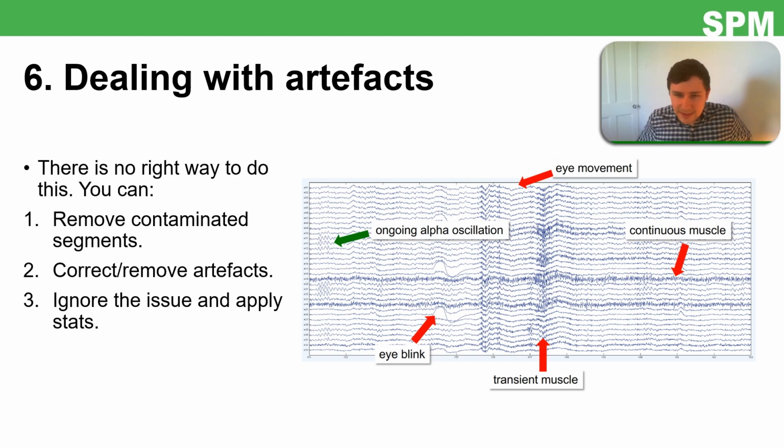Right, so this is back. MEG people can wake up, because this affects everybody. So how do we actually deal with artifacts specifically? I talked about filters, and that will actually help deal with artifacts. I talked about epoching. That might help a little bit.